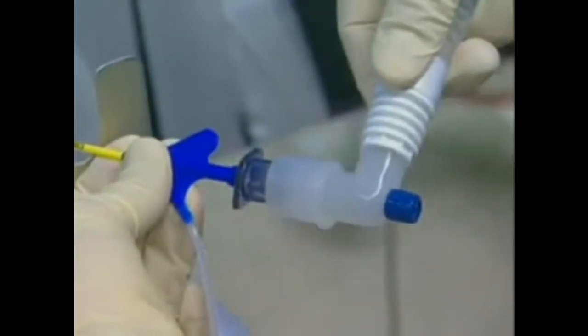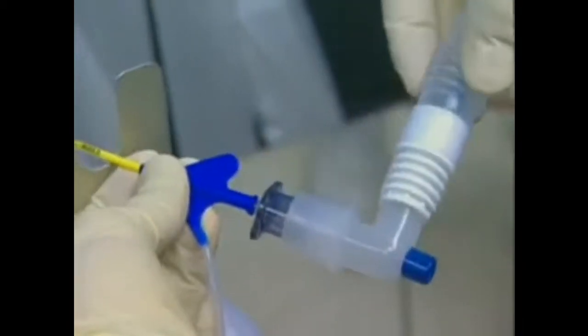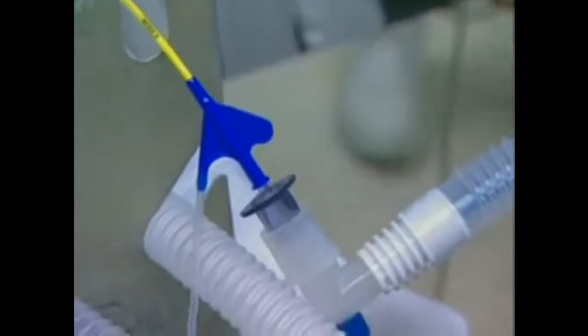Well, there are several indications for the use of a single lumen tube with an endobronchial blocker set, and I use it in both the setting of thoracic surgery as well as the setting of cardiac surgery.